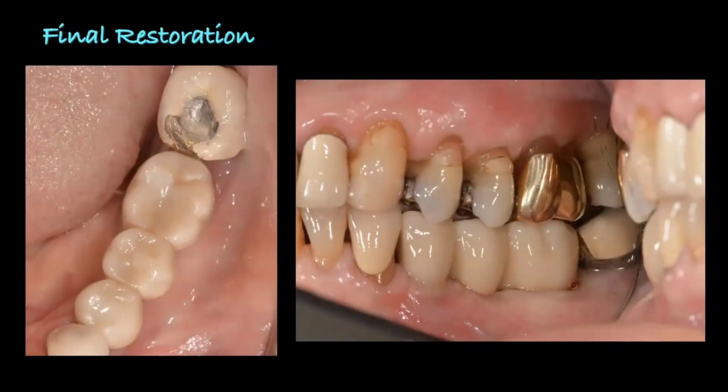And this is one darn good monolithic restoration, a monolithic bridge, which was done with one surgery, they had teeth in one day. But on top of that, our color match is pretty darn good for a monolithic restoration. I'm pretty happy with that. It's not perfect by any means, but he didn't want the yellowish portion of this old porcelain that was in the area. I think it matches and blends in quite nicely.